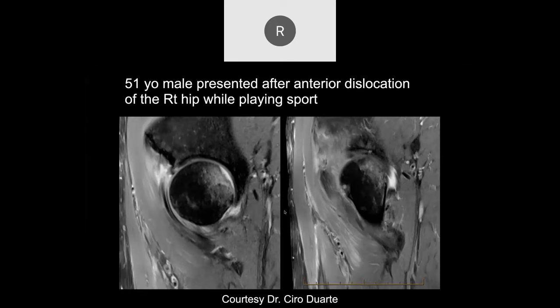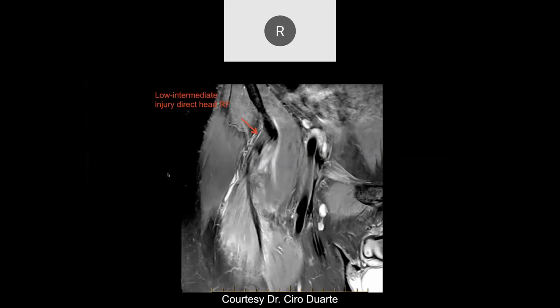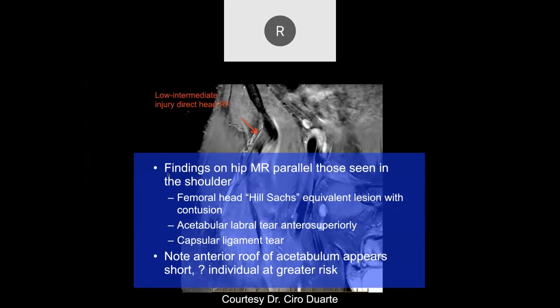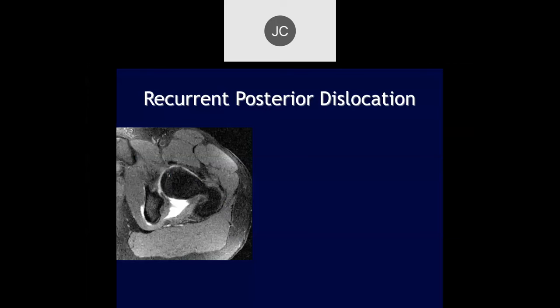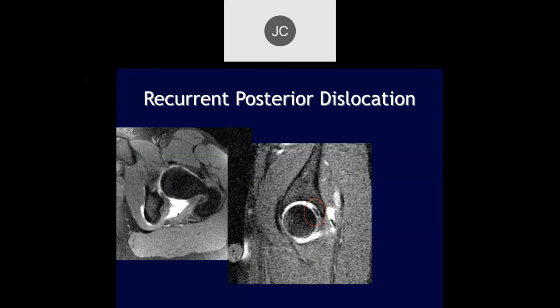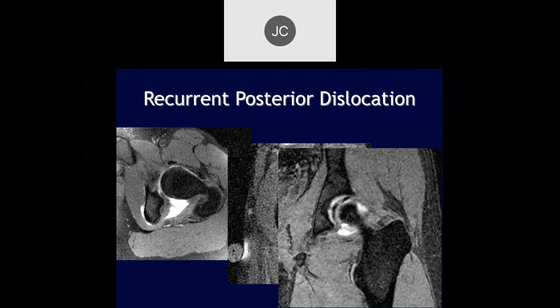51-year-old male presented after anterior dislocation of the right hip while playing sports. There's a lot of edema anterior to the joint space, and posteriorly on the femoral head there's edema with a contour defect and compaction injury — a Hill-Sachs lesion and an anterior labral tear. Also a strain of the direct head of the rectus femoris. In a patient with recurrent posterior dislocations, we can see deficiency of the posterior capsule and displacement of the labrum.